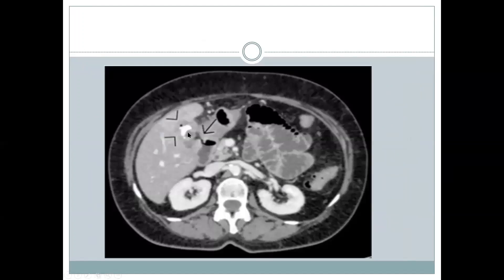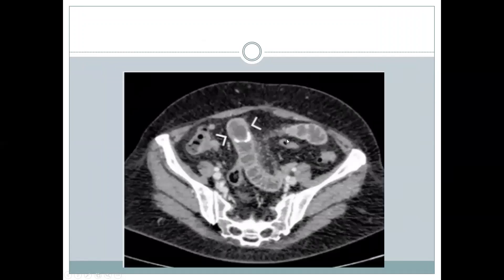Another image shows the gallbladder, which is deformed with calcification in its wall — this is actually a porcelain gallbladder. The duodenum is adjacent, and here is the fistulous communication between the two, with dilated gut loops. In the distal ileal loop, you can see a partially calcified gallstone.